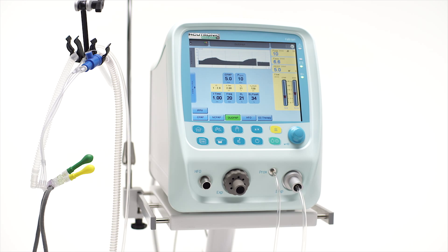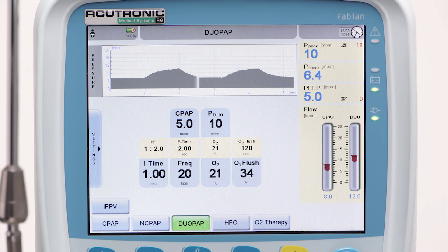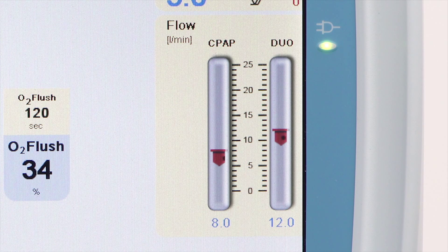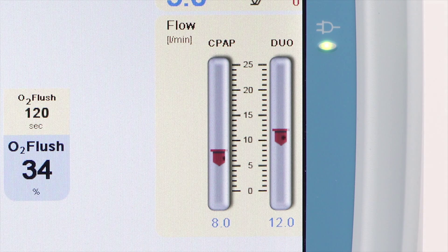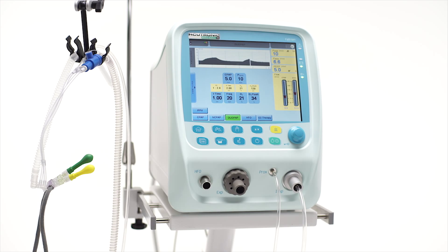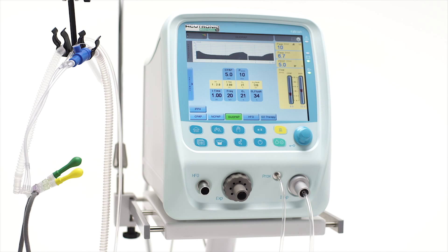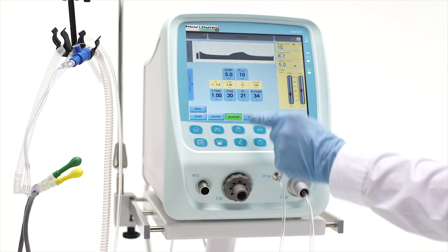In DUO-PAP, Fabian will automatically adjust the flow for the two different pressure levels and display the used flow rate for each level. The transition from one level to the other allows stimulation of the patient in case of frequent apnea events. DUO-PAP, as a bilevel CPAP, may also increase the CO2 washout in case of ETCO2 retention problems.